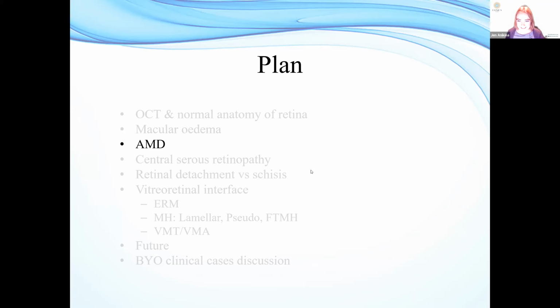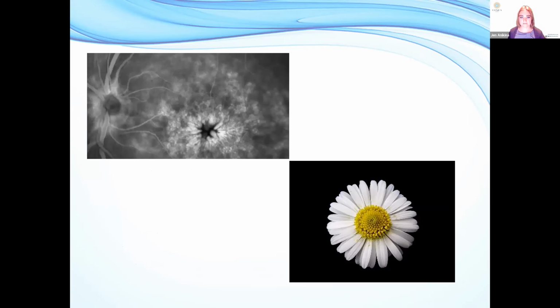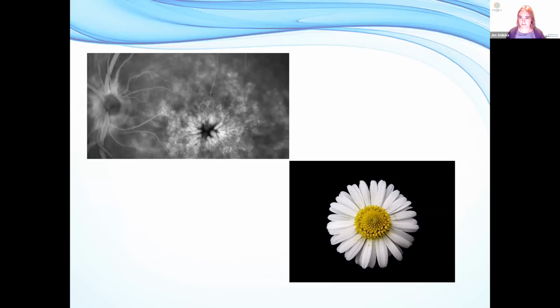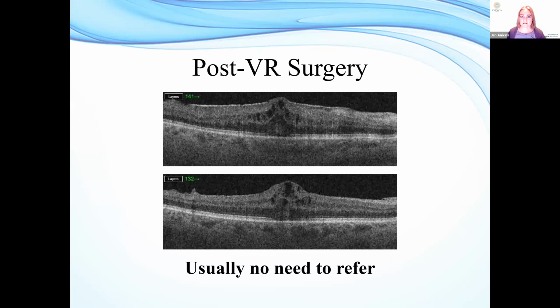You missed the petal slide and answer to question one. Question one answer was cataract surgery. So having had cataract surgery in the past is not a risk factor for developing diabetic macular edema. And the petal slide, I shall demonstrate for your viewing pleasure. This is the petal slide with the questions. Lovely. So have we got any more? That's fine. We answered that, and that, and that. Lovely. So I'll crack on with the next bit.